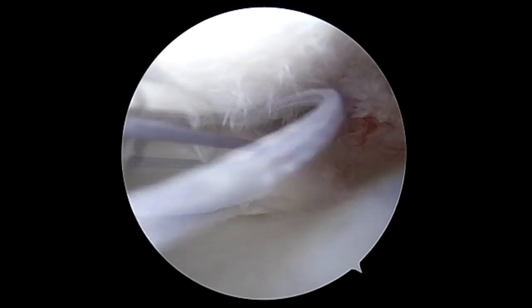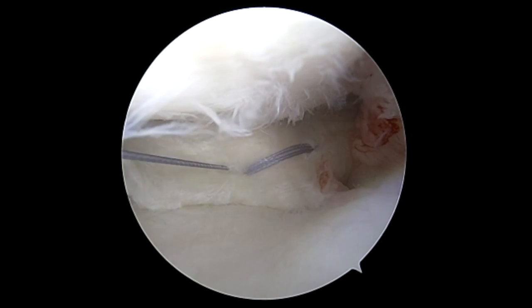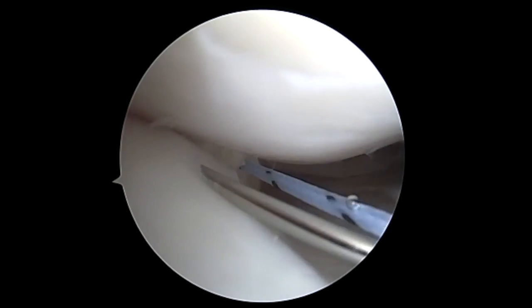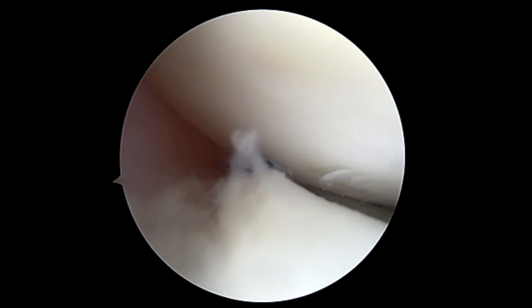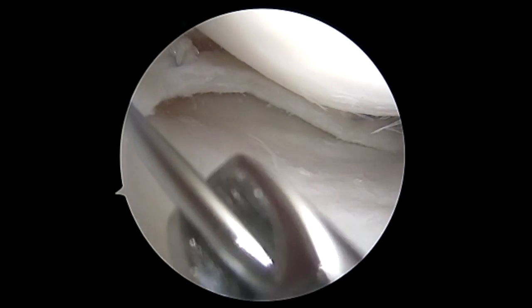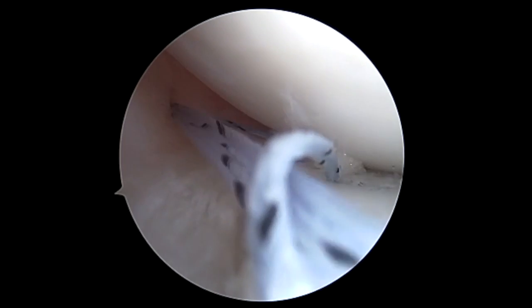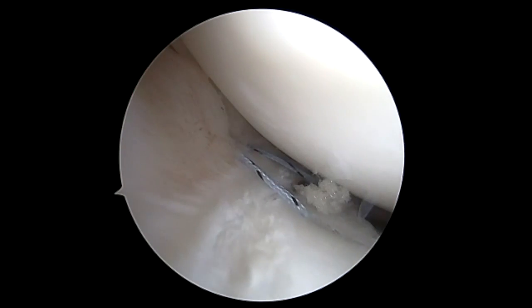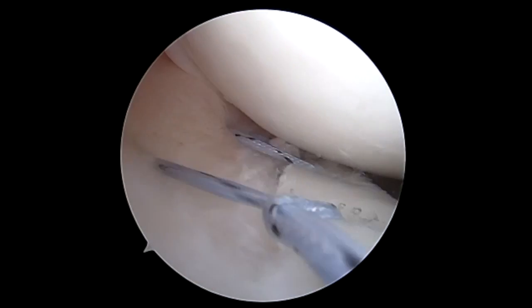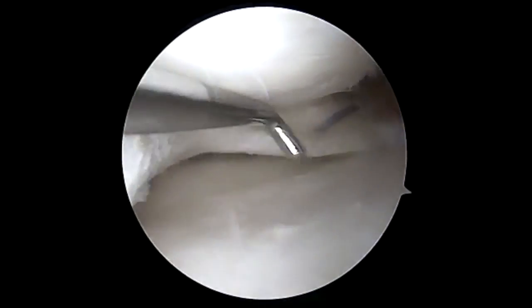This is nice because it has two limbs for more thorough fixation and better biomechanical strength and pull out. After this, we're going to turn our attention towards the inside out repair. Again, these are suture tape needles, and we're going to place multiple into the meniscus fragment in vertical mattress fashion. This is the highest biomechanical strength, and you can already see that we're getting excellent compression of the meniscus back to the capsular tear. We're going to place multiple in the periphery using different guide systems.